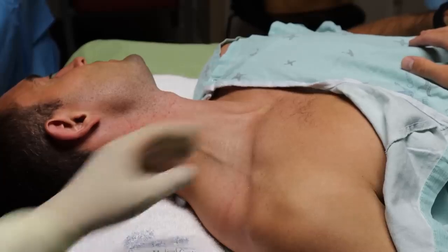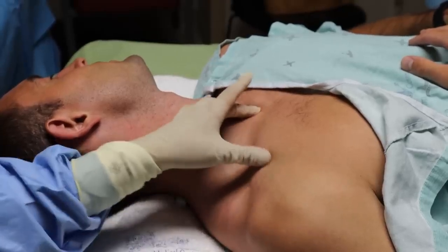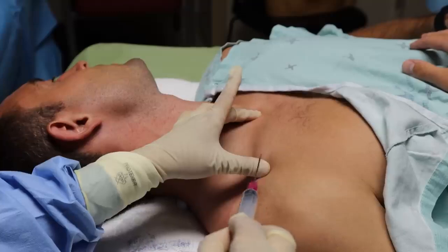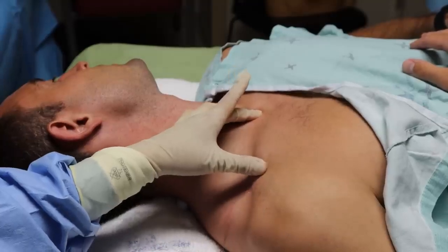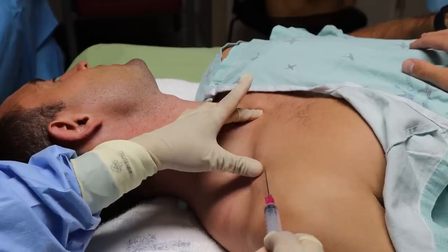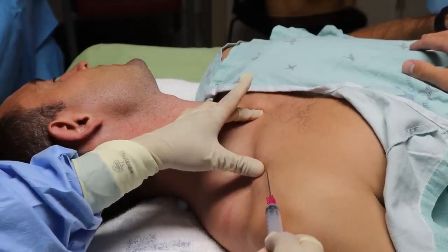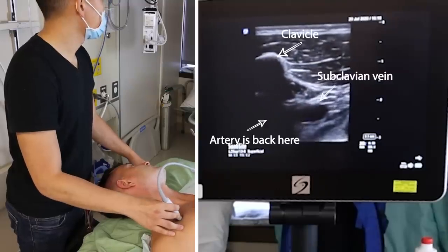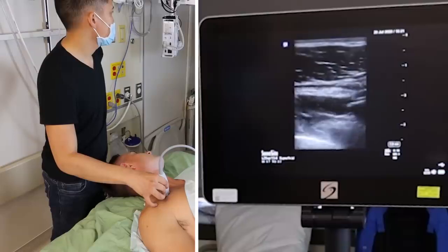For the blind landmark guided approach, put your index or third finger on the sternal notch, and then put your thumb on the prominent bump of the clavicle where it starts to bend toward the shoulder. Insert the needle next to your thumb and aim the needle at the finger on the sternal notch. Aspirate as you advance and you'll hit the vein. Here's the infraclavicular short axis view of the subclavian vein. And here's long axis.